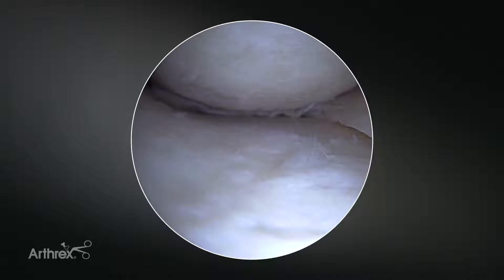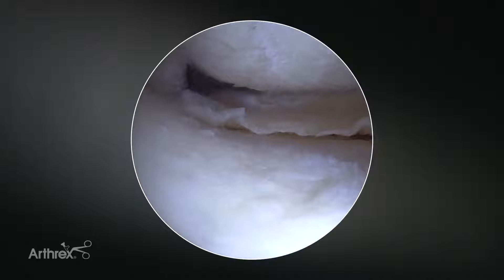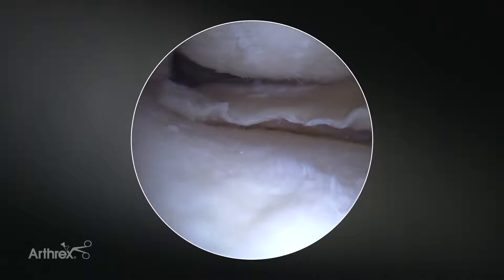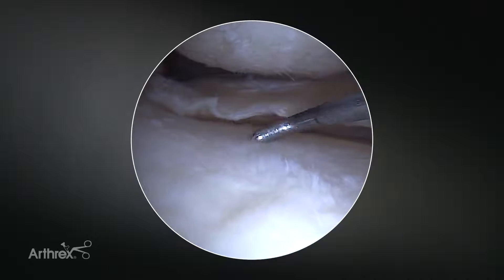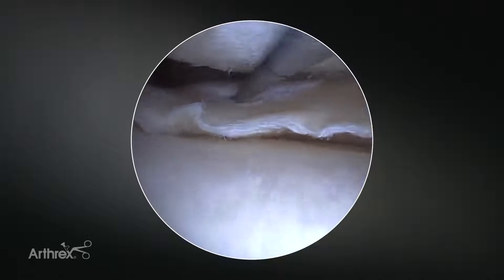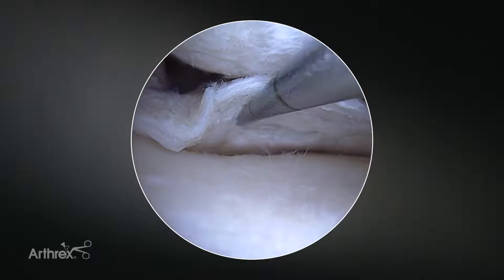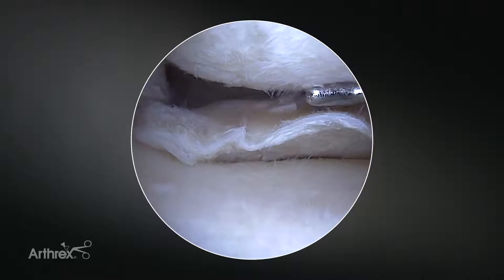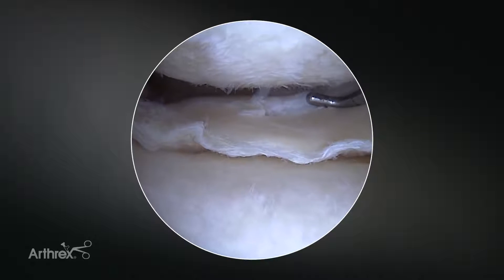Here we're in a right knee, in the medial compartment. We're going to come into extension with a little bit of a valgus load. My assistant is going to be helping. What we've already done is performed an MCL fenestration to allow us adequate access and visualization of this peripheral vertical longitudinal tear. You can see both the femoral side of the tear as well as the tibial side. We are going to be addressing each of these independently to get multiple points of fixation and really mimic an inside-out repair.